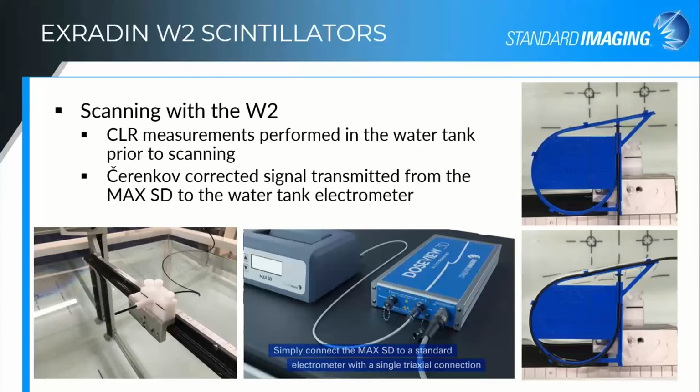You do have to scan slowly. We recommend a point-by-point measurement of about a second at each dwell point, and really that's to allow the system to overcome some of the signal-to-noise limitations.